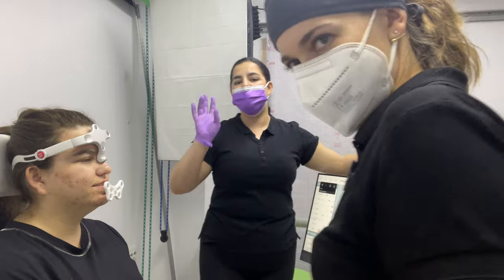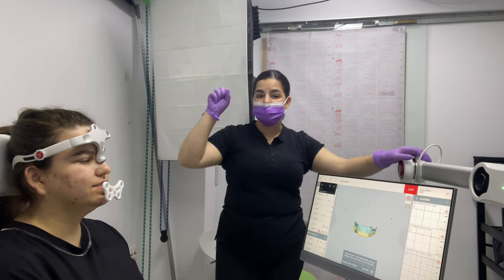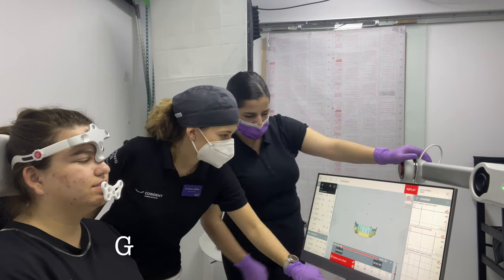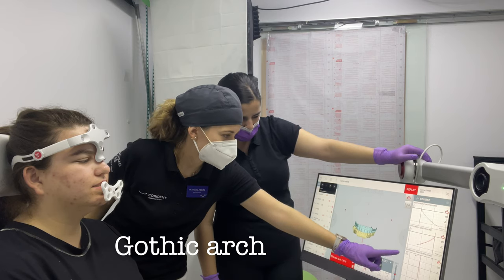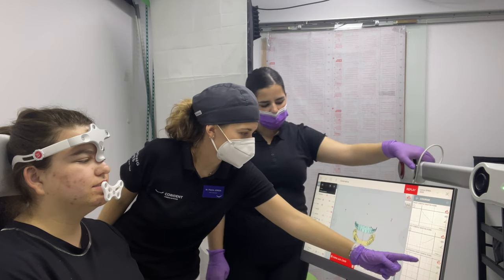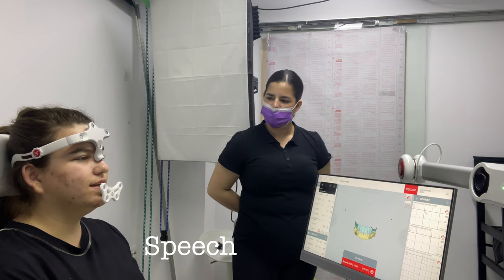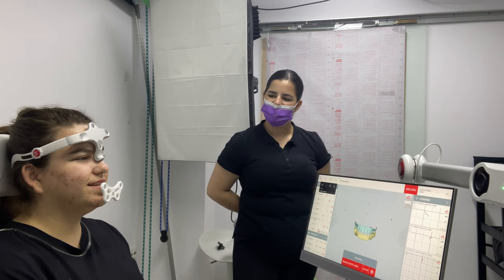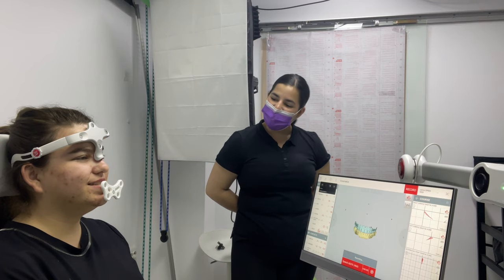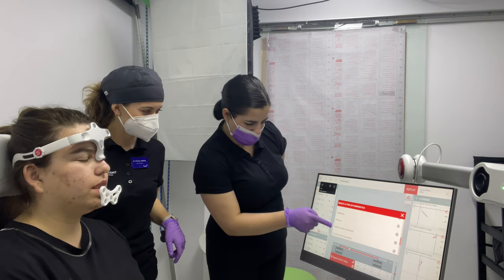So now we're going to do what's called the Gothic Arch. So we're going to do tap, tap, tap. Then she's going to do open, close, left and right. Go. 61, 62, 63, 64, 65, 66, 67, 68, 69, 70.